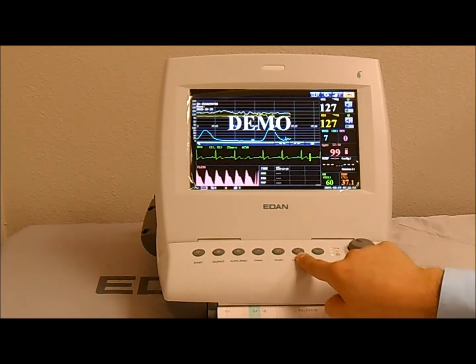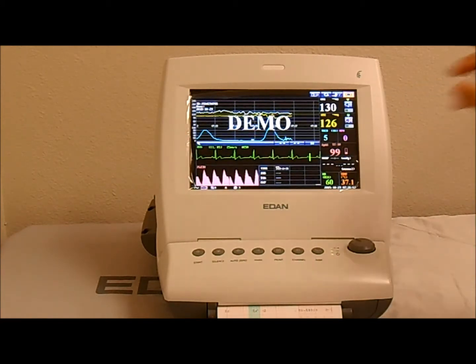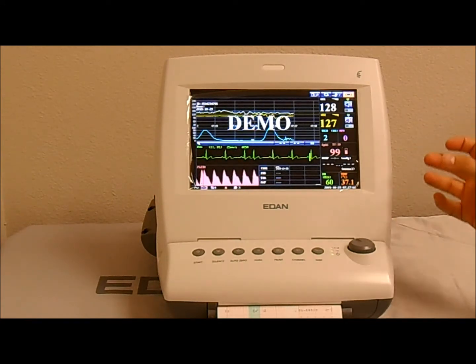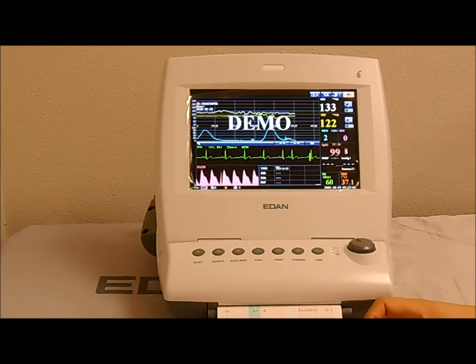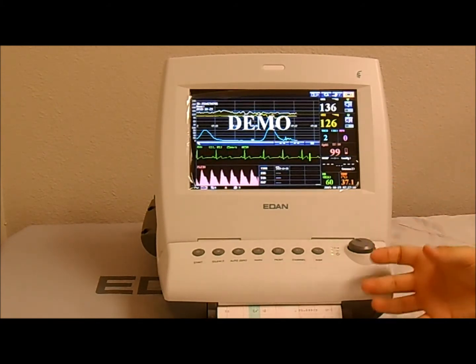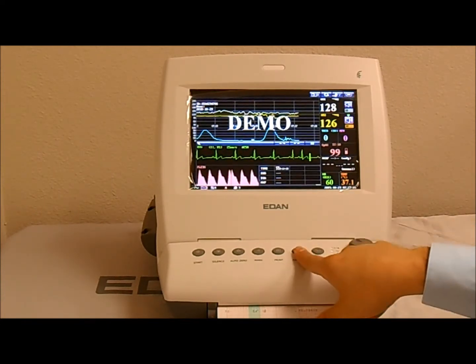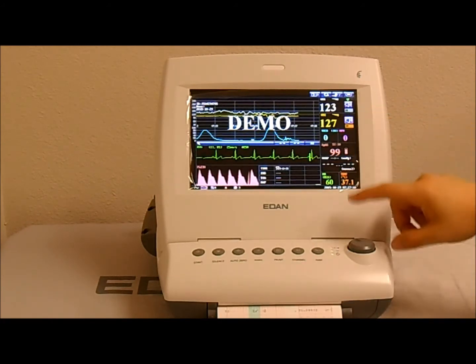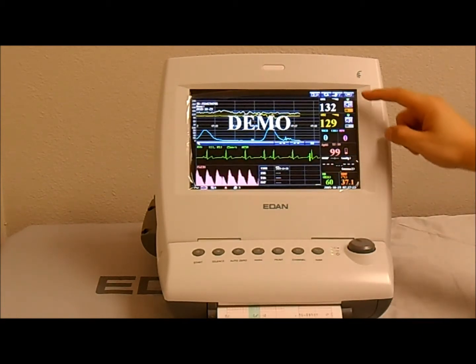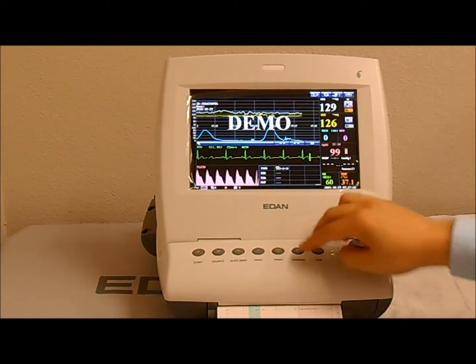Next we have the channel key. The monitor will give you FHR feedback, so it'll give you the sound of the FHR. If the patient has twins, you would have 2 FHR transducers on the patient at the same time, but the system can only give you the FHR sound of one transducer. Otherwise there's going to be overlapping sounds and it's going to be chaotic. So if you press the channel key, you go from the sound feedback of transducer 1 to transducer 2. So you go from FHR 1 to FHR 2. That's the channel key.